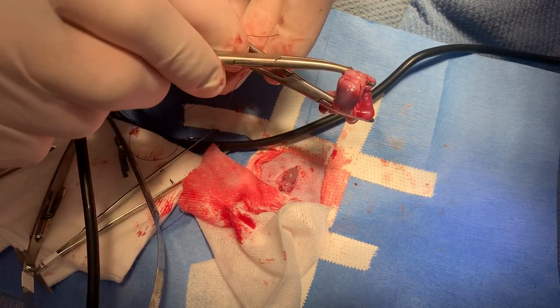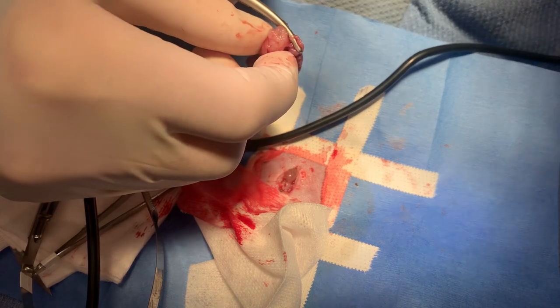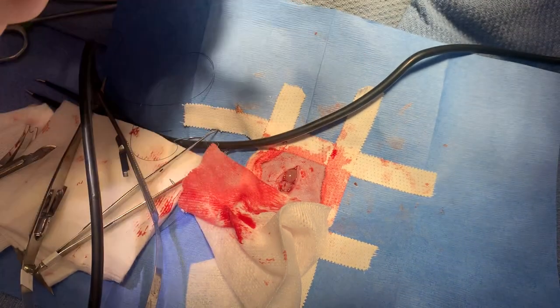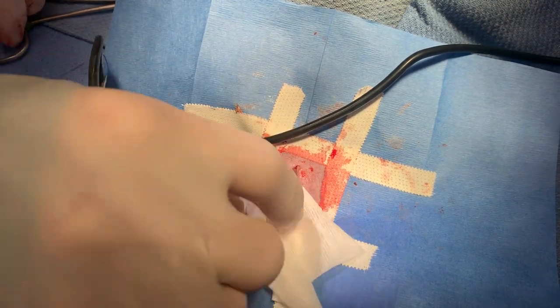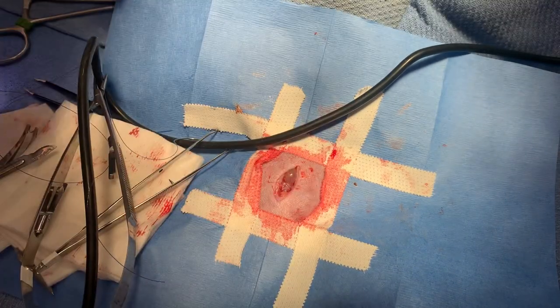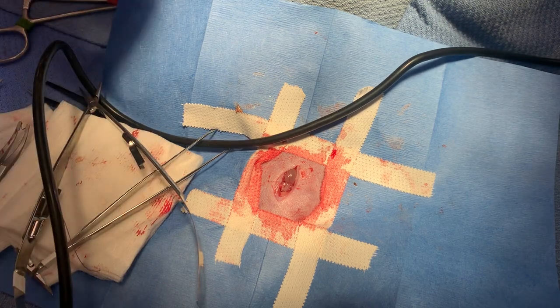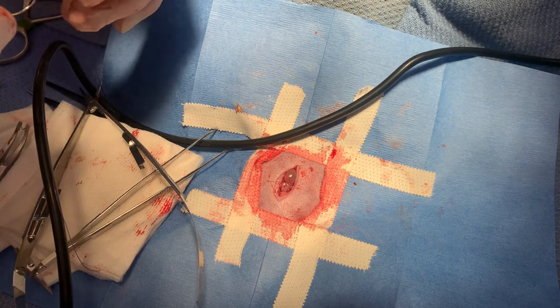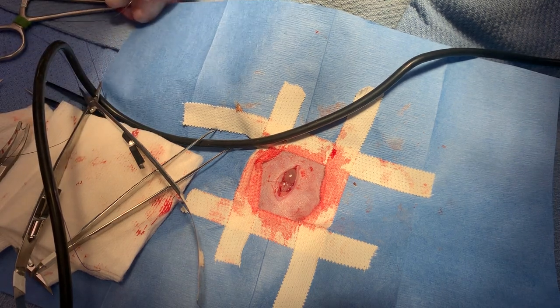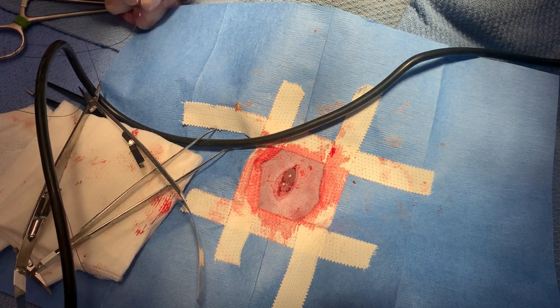Those are uterus out. From the look of that tissue, I'm more concerned about neoplasia, in which case I don't know that we could have gotten all of it. I guess we could go all the way to the vagina. Let's at least get some impressions of it. And then, okay, I'm gonna get some of this stuff out of the way.